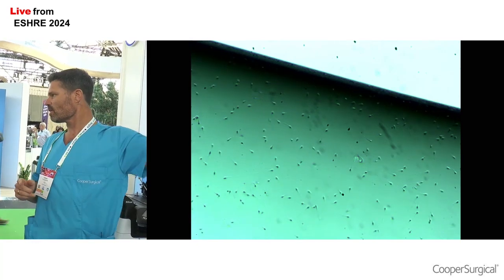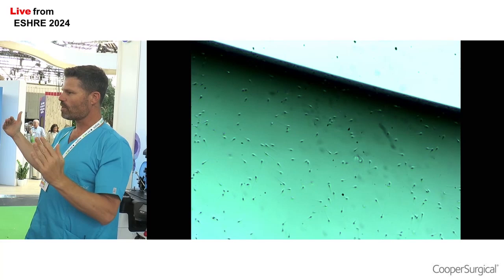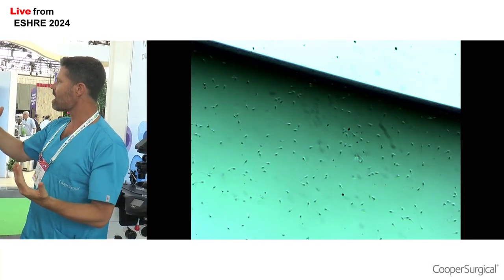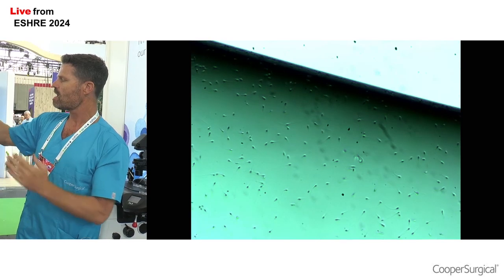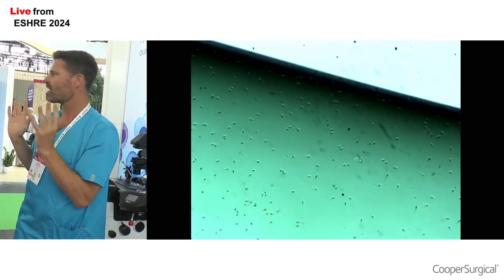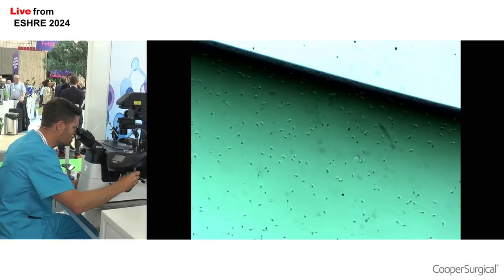As we get along there, we are going to arrive to a place which is like the interface between media and SpermSlow, where the sperm which have the receptors for hyaluronic acid aren't able to penetrate through. So they'll still be motile, they'll still be beating their tail, but you'll see that they'll slow down, and what we'll start to see is kind of an interface where there's more sperm which can't get through. So let's see if we can find where that is.